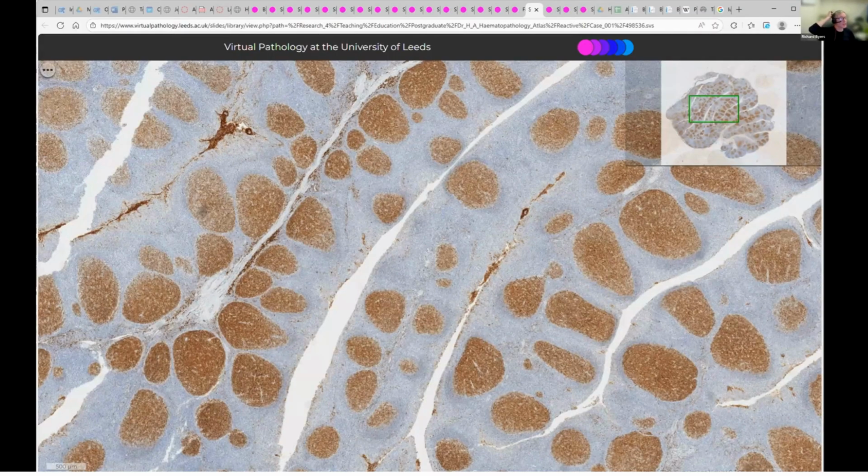Okay, Pilar has got a question. Could you please tell me which differential I should consider in a mixture of cellularity Hodgkin lymphoma, with flow cytometry? Most common infections have been excluded in microbiology. So this is a case you've got, Pilar, is it?